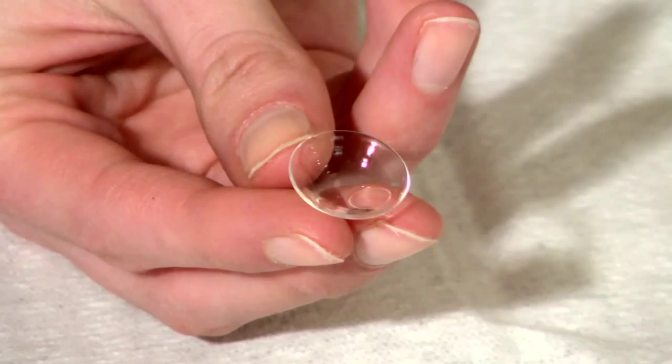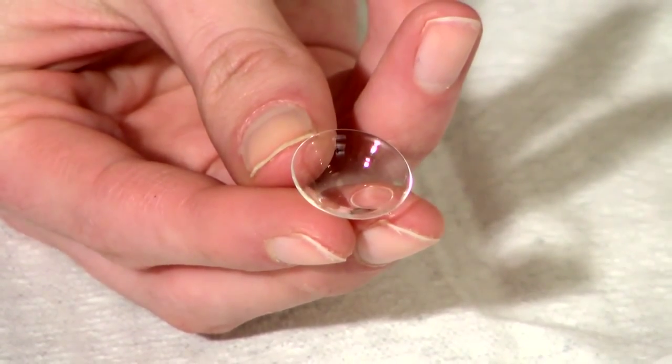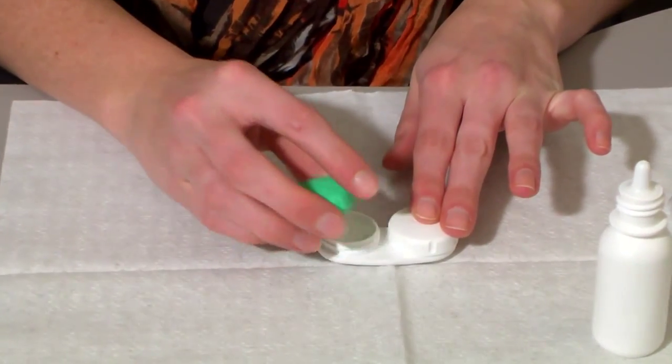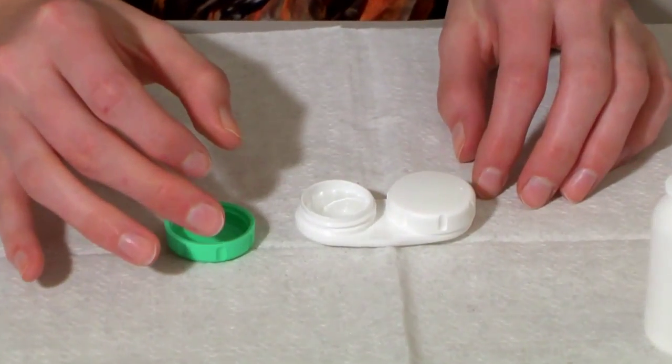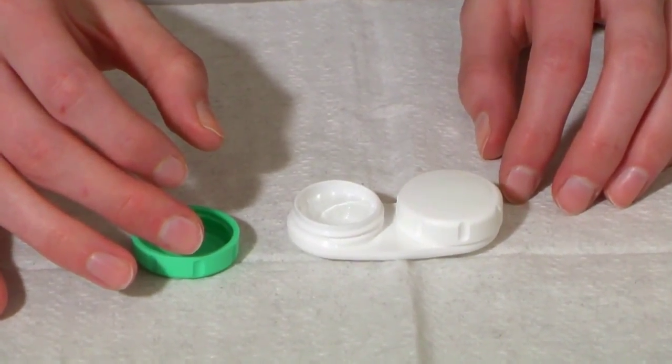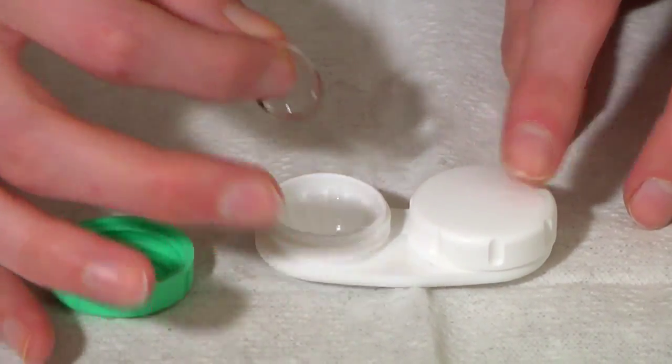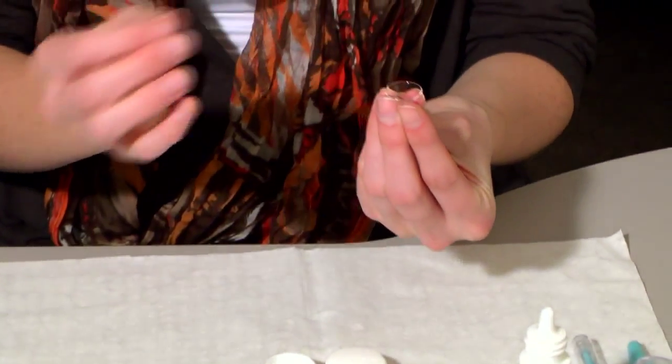Even though your contact lenses may have different prescriptions, they may look identical. To avoid mixing them up, get into a routine and always start with the same lens when you apply, remove or care for them. We'll begin with the right lens.